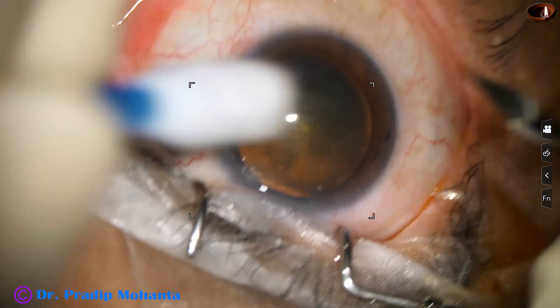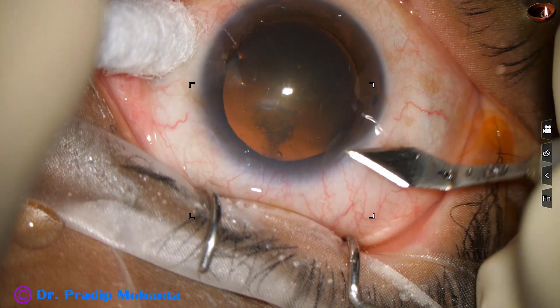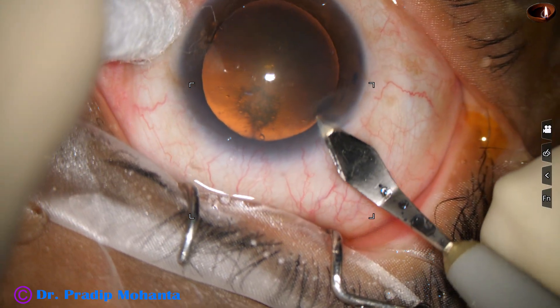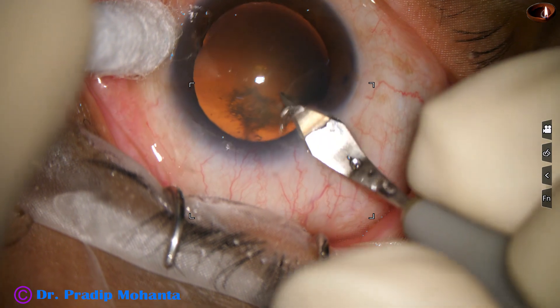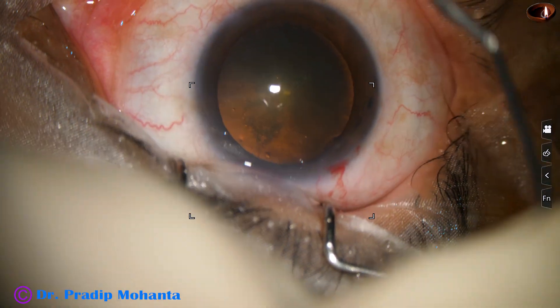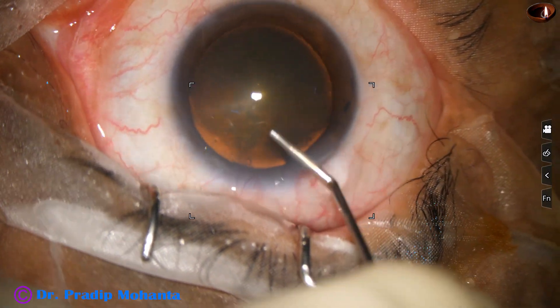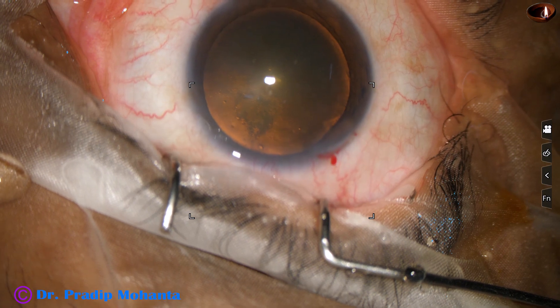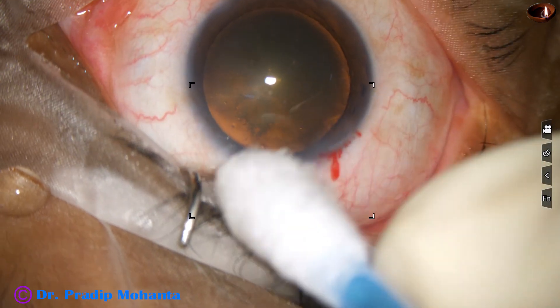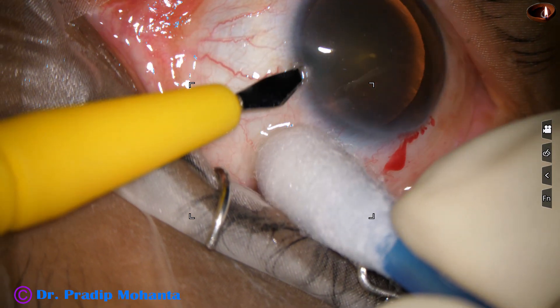This is a totally unedited recording from this point. This is the main incision with a 2.8 millimeter steel keratome at around 11 o'clock. Now 2% hydroxypropyl methylcellulose is injected into the anterior chamber, and a side port is made on the left side of the main incision, about 3 clock hours away.